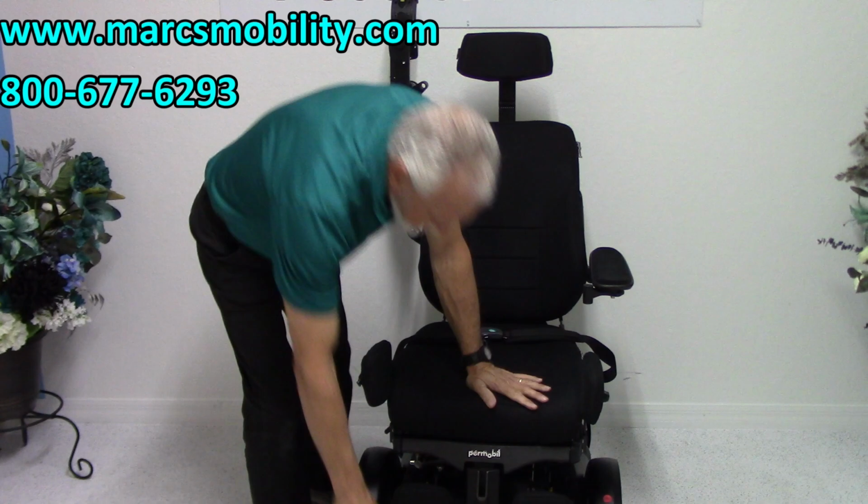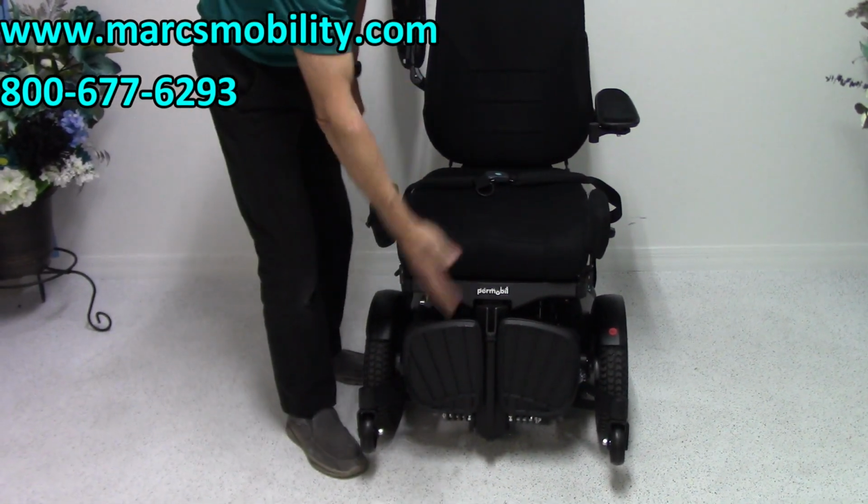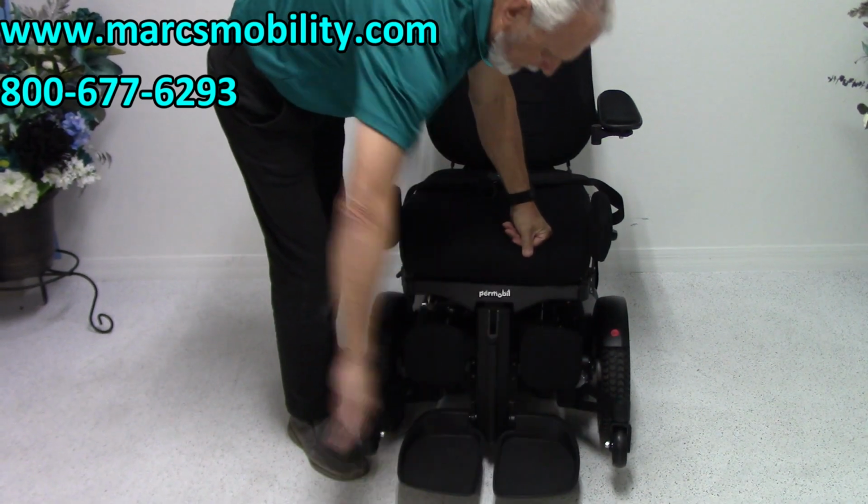Your foot plate does flip up when you exit the chair. You can flip up the foot plate. You can walk right out. There's nothing in front of you.